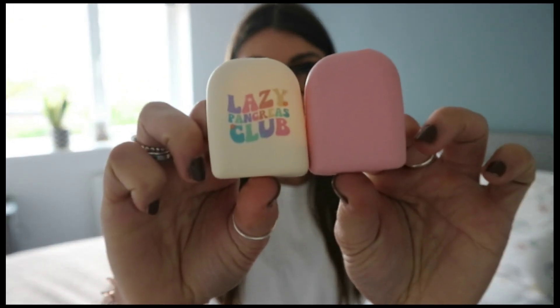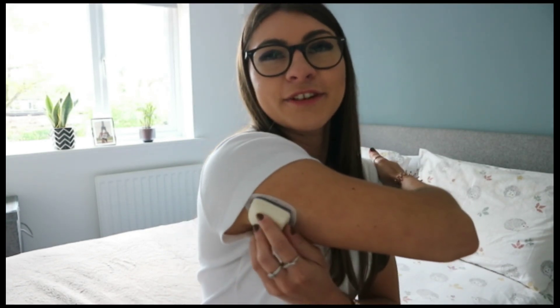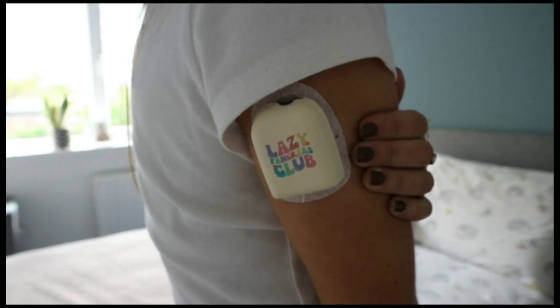In terms of people looking at my diabetes tech — I honestly don't care anymore. I proudly show it off, though I do often catch people looking at my arms funny because they just don't know what it is. If someone came up to me and asked, I'd be more than happy to let them know. These little covers are so freaking cute — I haven't worn this one yet but I definitely want to. Let me show you guys what it would look like on the pod. How cute is that?!